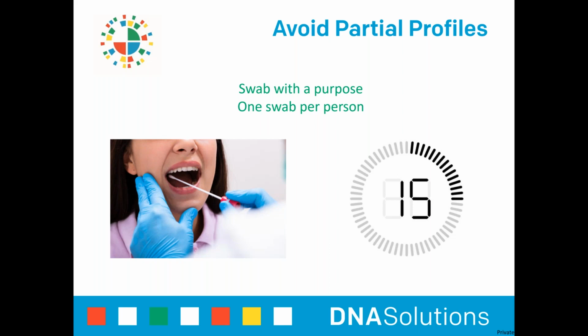Often collecting young children and babies can be difficult, as they can push away the swab with their tongue. In these situations, you can run the swab tip along the top gum line in addition to the inside cheeks. We encourage collectors to start with any adult participants and calmly speak with children as you perform the collection to reassure them how easy and pain-free the process is.